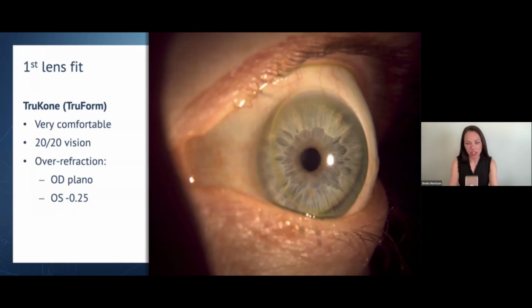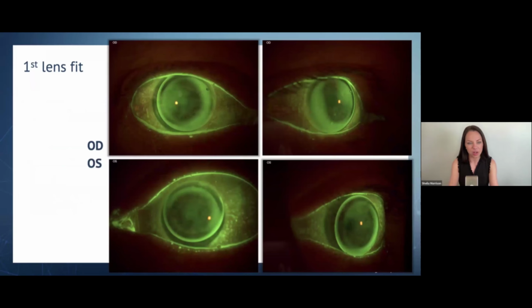So I wanted to share some digital images here as well, some anterior segment images. This was a first lens fit based off of empirical design on a trickier eye to fit. He tends to get central adhesion with a lot of fits. In fact, I had tried diagnostic fitting him just before we did the mapping, because I needed his acuity potential, and found that even a very, very flat corneal GP fit almost like an OrthoK lens on him.